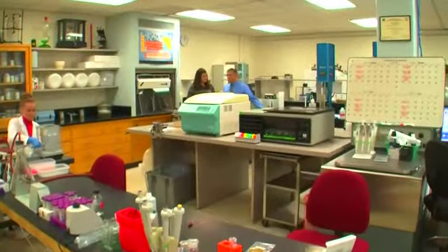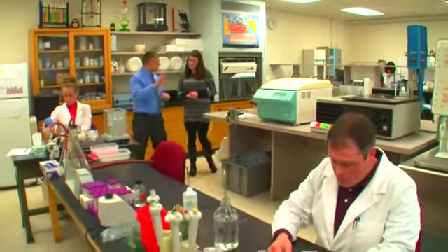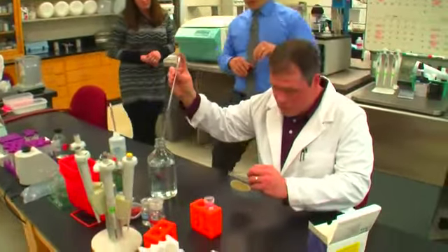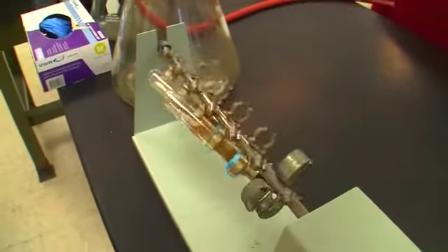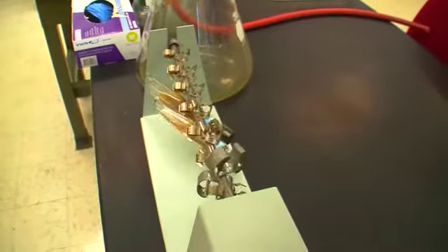Okay. After we've removed the pathogens and put them in solution, they'll be concentrated down through a centrifuge till we have around 50 milliliters of sample. This is where Paul is taking over here. He's going to take these filters, rinse them off. It goes through a process known as immunomagnetic separation, and you can see this process over here. We add some antibodies that are tied to magnetic beads. They mix for about an hour, and the pathogens are bound by those antibodies to the magnets. We remove the magnetic beads, and then they are spotted on slides for analysis after staining in the microscope room.